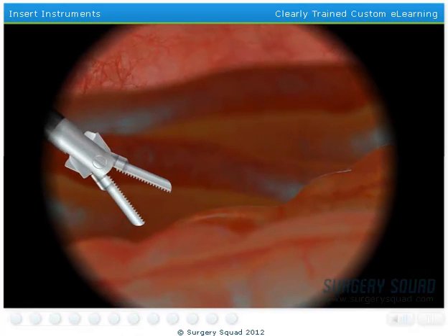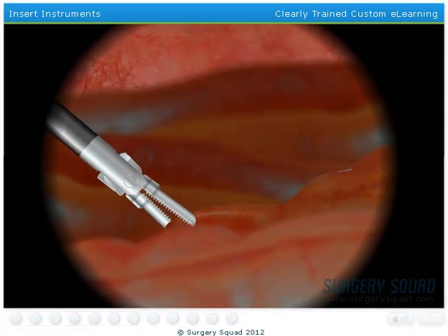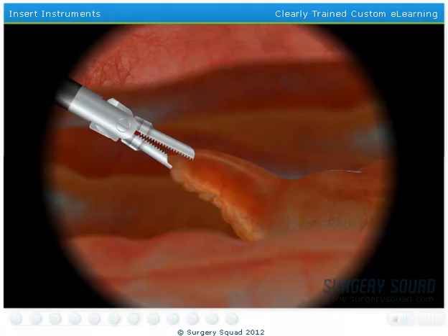The inflamed and swollen area you see is the patient's appendix. Our next step is to remove it before it becomes an even greater problem for our patient.